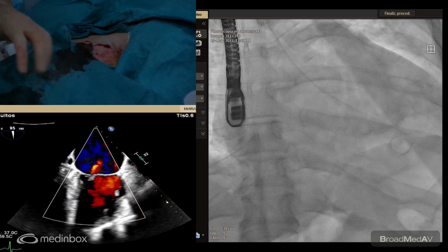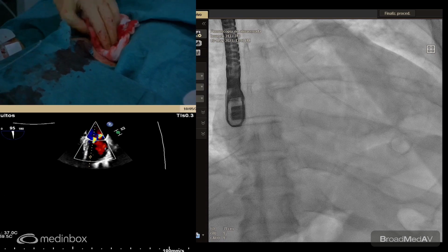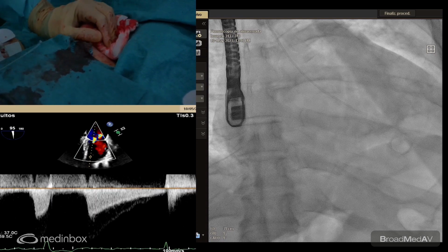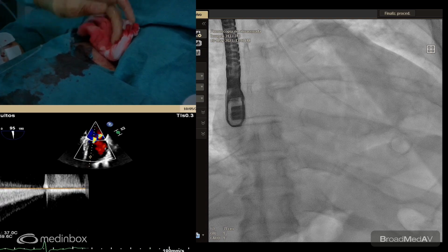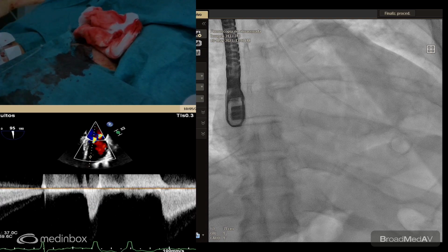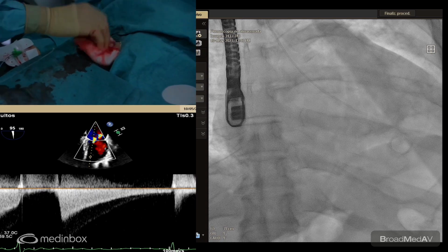Any questions, Clara? No. There aren't any new questions. As you can see, it's closer. I'm going to press a little bit, 30 seconds. But I think if there is no question. If you have questions, my Twitter is.